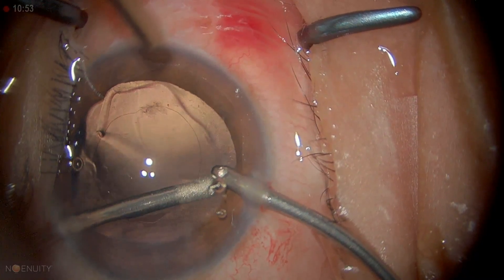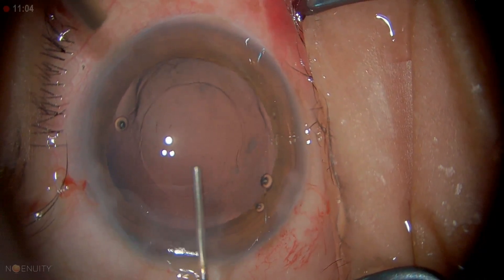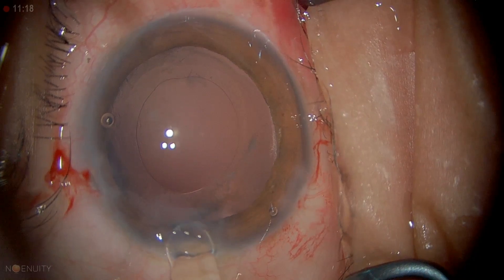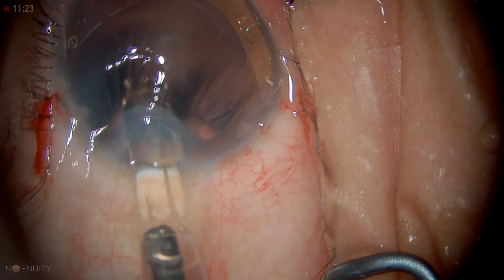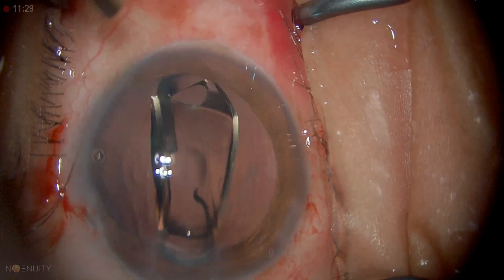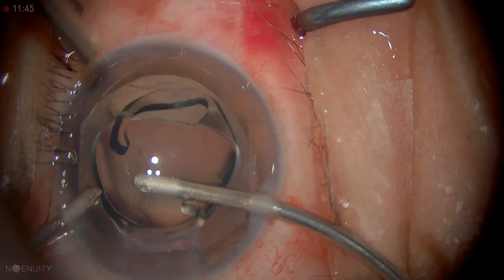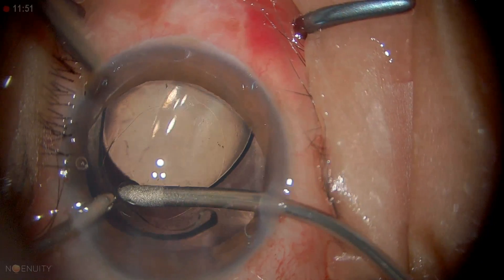There's a little bit of fibrosis there — we just leave that alone, it's not going to cause any problem. Now I'm going to fill the eye with ProVisc. The lens is nicely loaded. Just going in, open up the lips and gently inject it downwards so that the leading haptics go into the capsular bag. You can use the bi-manual itself to nudge the lens in, and sometimes this method may be necessary.